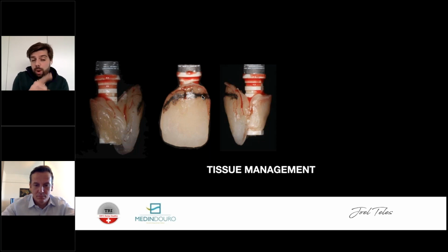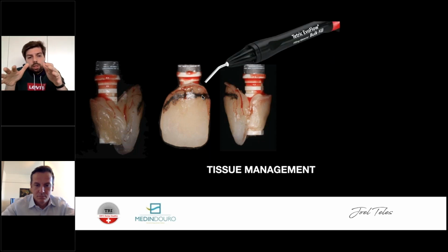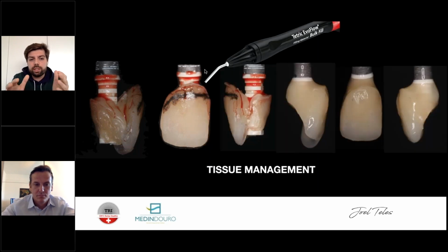While I'm doing this, and this is very important, my assistant is always keeping the tissues very moist with saline irrigation, because at this moment the patient is waiting and I'm preparing this, okay? So I'll come with flow composite, and I'll slowly start to reshape all of this. And for that question that somebody asked, you can see here that the peek abutment is not that wide, it is not making any compression. We'll start to reshape it, leaving space for the tissue, thinking about what José Carlos Rosa told us about those 3 millimeters.